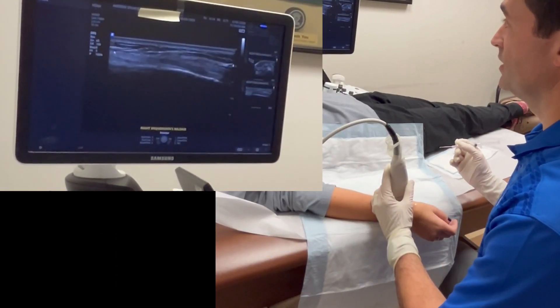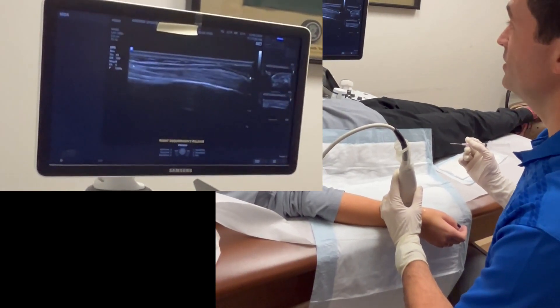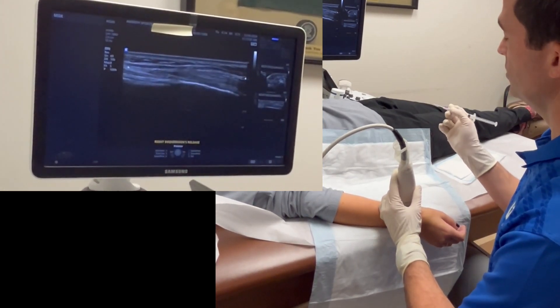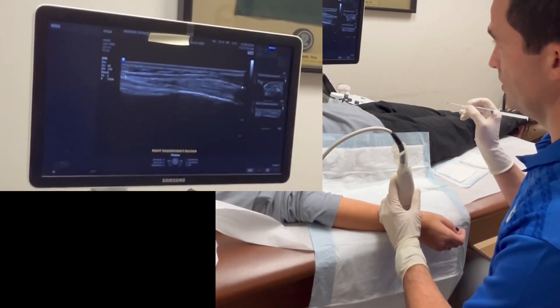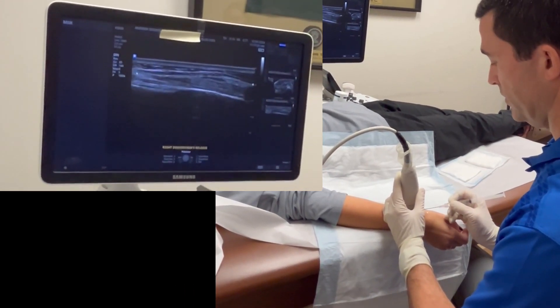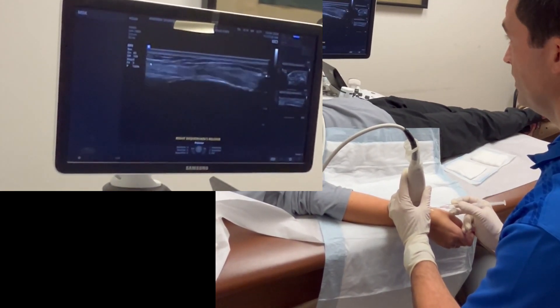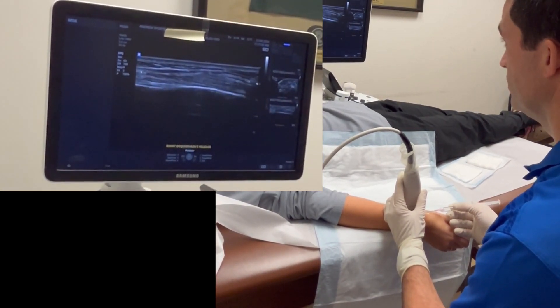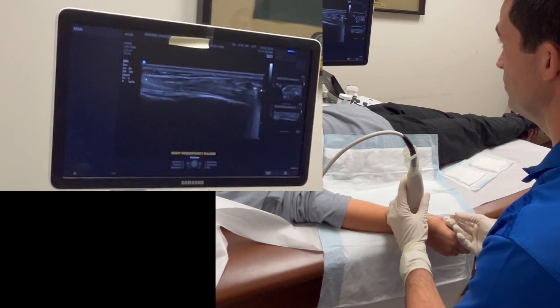We're going to proceed with the actual incision through the first dorsal compartment tendon sheath and the extensor retinaculum. We're using an 18-gauge needle that has a blade on the tip called the nilcore needle — it is a needle with a scalpel at the tip, so we make a full incision to achieve a complete release. At this point we should have full anesthetic effect. We'll do our puncture, identify the retinaculum and tendon on the screen, advance the instrument down to the extensor retinaculum, and make sure we stay superficial to the tendon so we don't injure it.